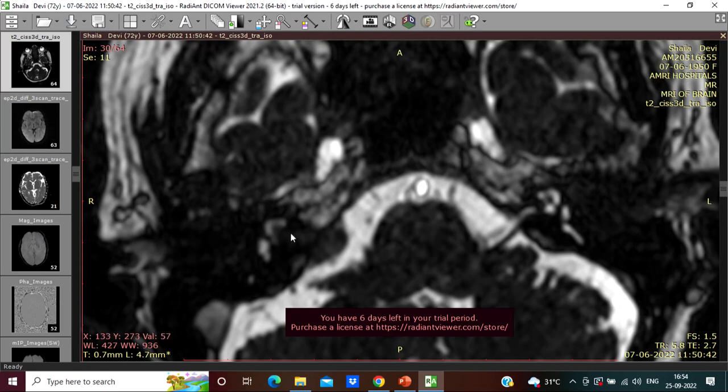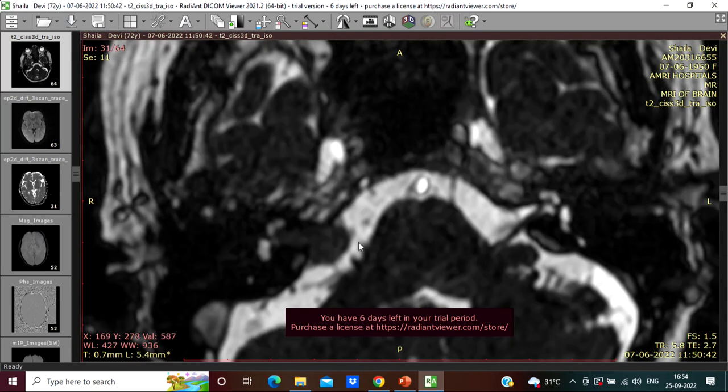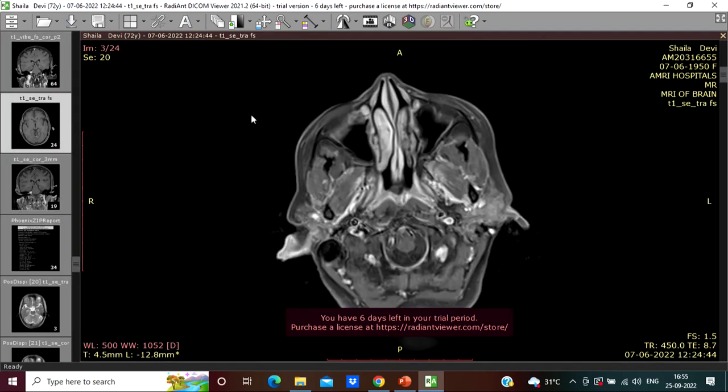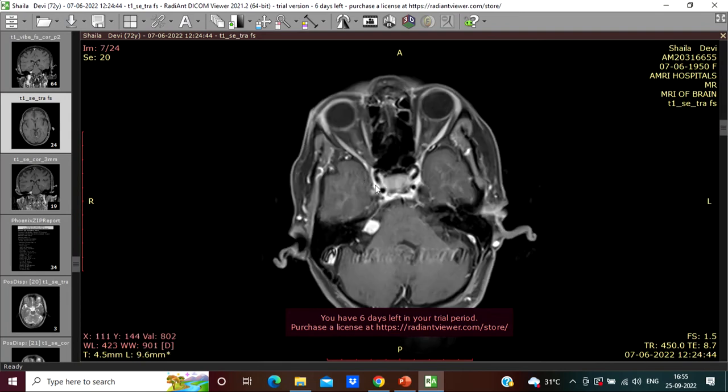There is no fluid level lateral to the tumor. Fluid level means bright appearance lateral to the tumor, which signifies the lateral extent. See this, where the tumor is going to? Far right up to the level of the cochlear base. Now, this is hypodensity on T2, and how is it confirmed further? See this.